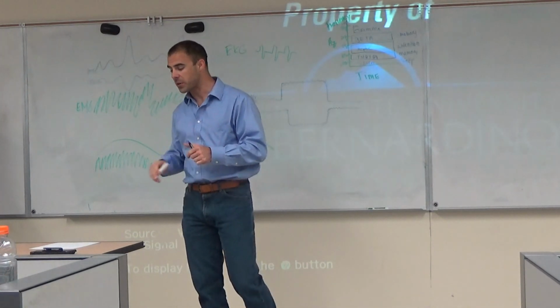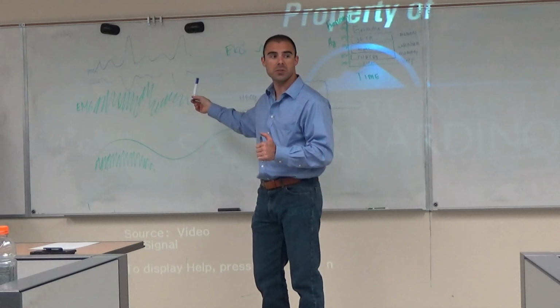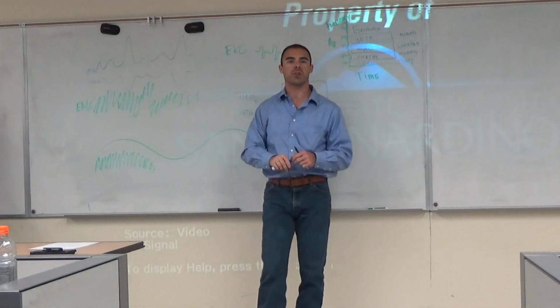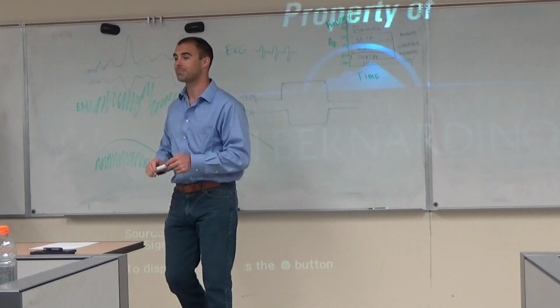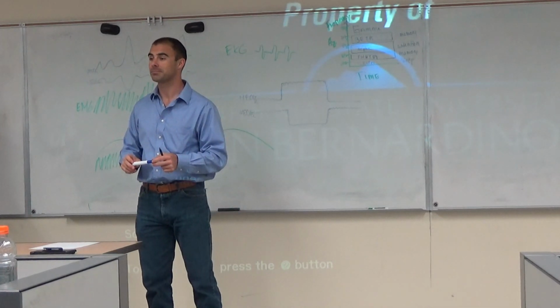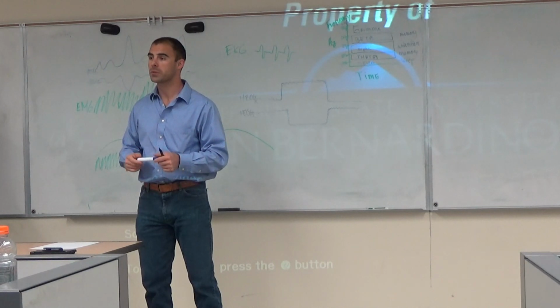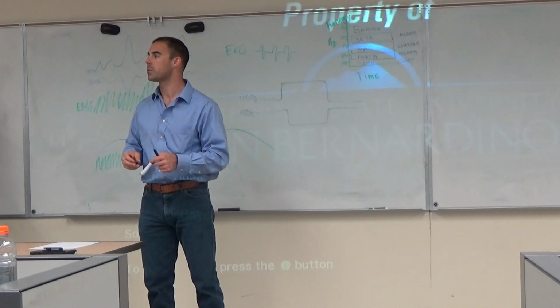Okay, so we talked about some of these now, and other parts of the question were ways to deal with these things. So if you see blinks in the data, what's one thing you can do to either prevent it or to cure it once you see it? Yes, Kelsey? Tell your participant not to blink when they're looking at the word. Yep. And is that also part of why you can give them a little focus cross, because it gives you somewhere to look, but also, hey, you can blink now? Yes. Okay, Ryan, what's a way that you could deal with it if they happen to blink?